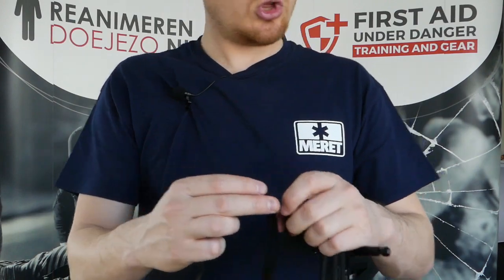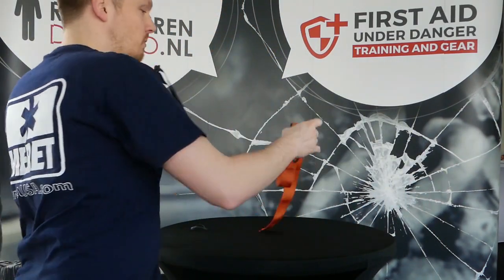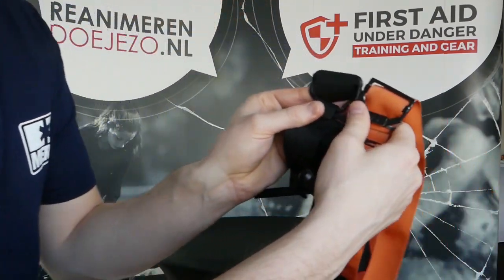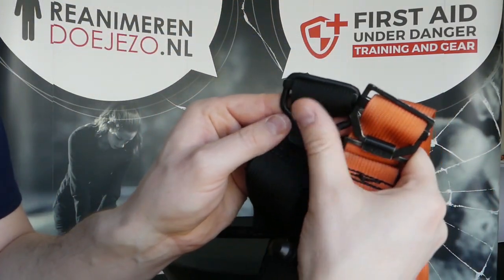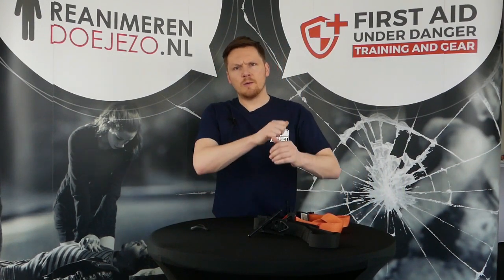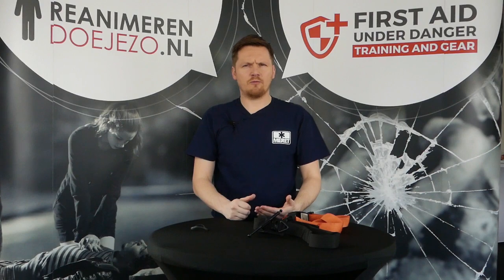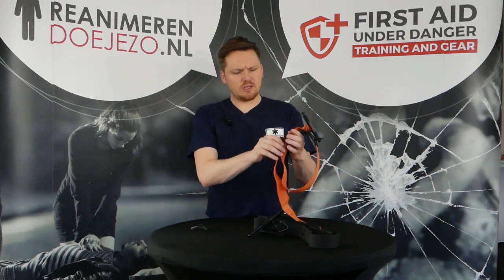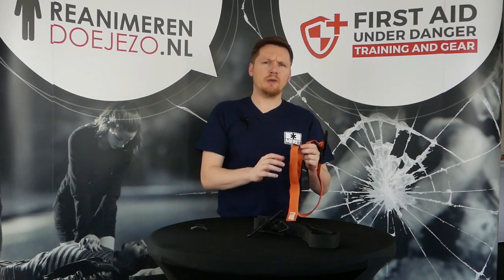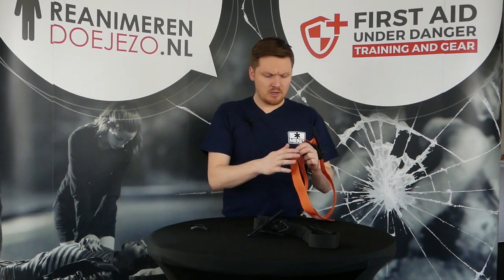What else has changed? Well, another main problem, because these are double looped, hopefully you can see it, they're double looped, and double looping means that it's not always easy to get the tourniquet on for self-aid because it doesn't really slide as easy as a single looping.